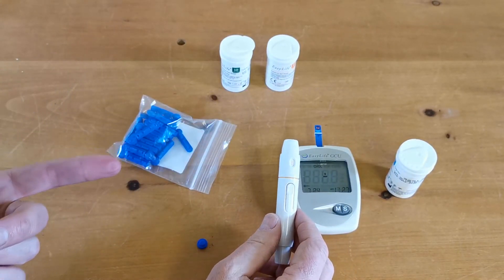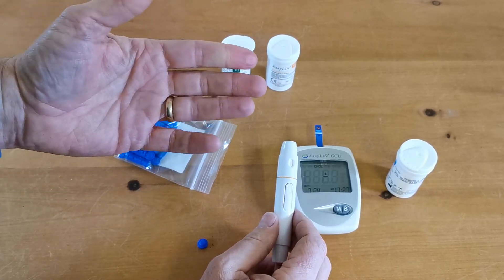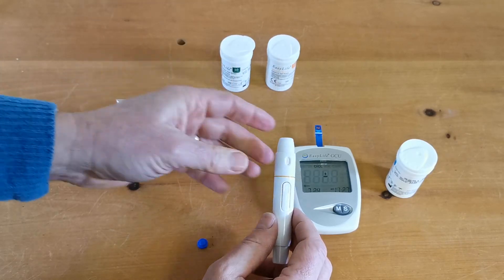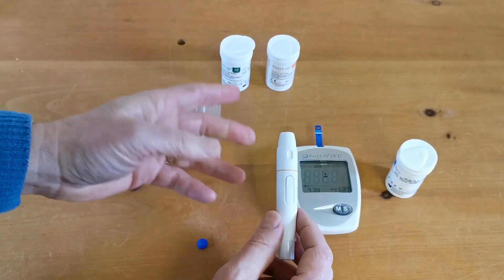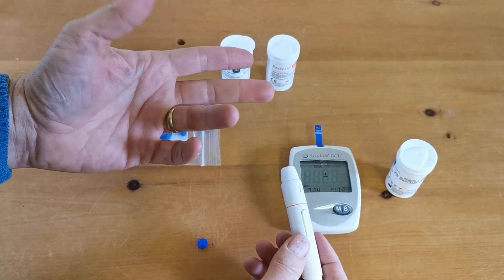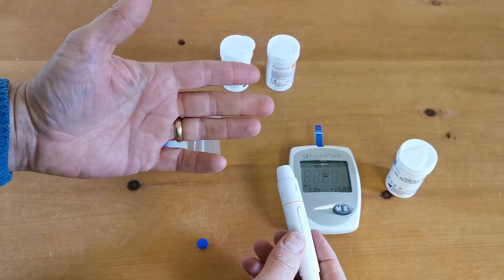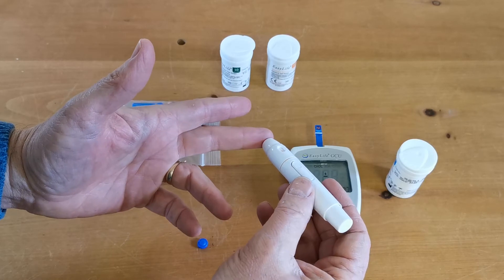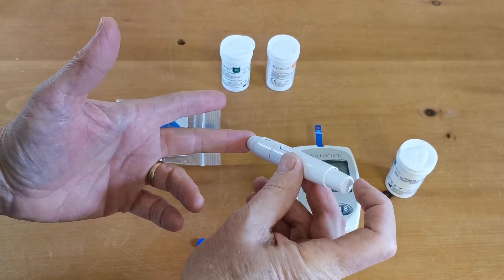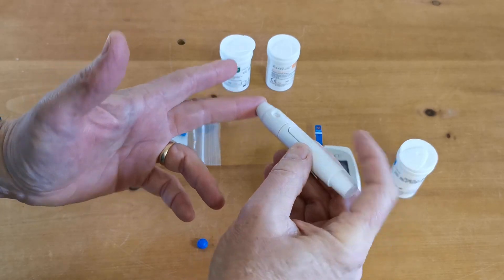When you're ready to perform the test you need nice warm fingers. Clean and wash your hands and try to get them as warm as possible so they're well perfused. Then just apply the lancing device onto the finger pulp where you're going to take the sample and trigger it.